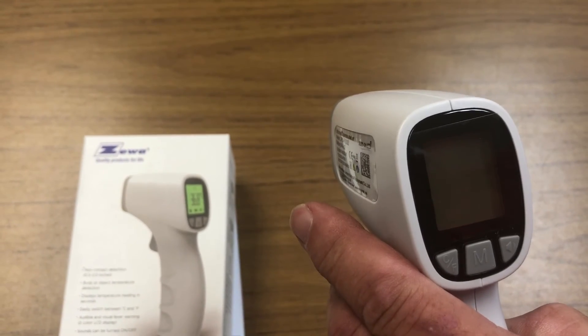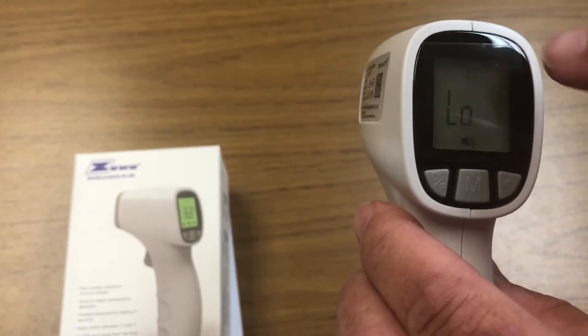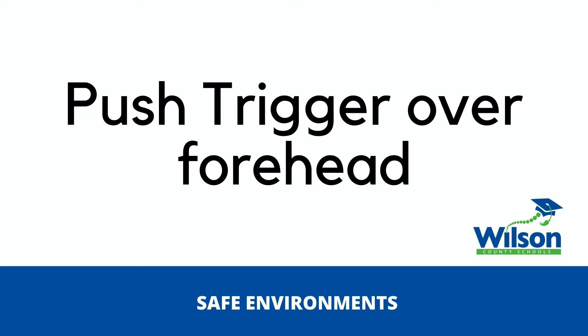Make sure the head icon is displayed at the top, confirming it is set up for human temperature. Once you take a temp, that is your reading.